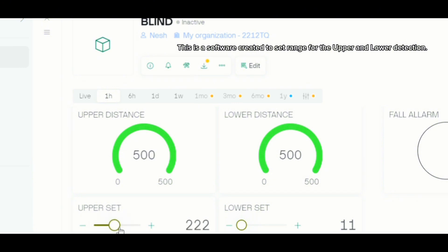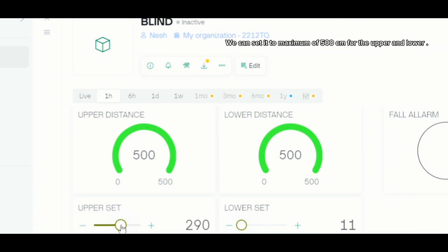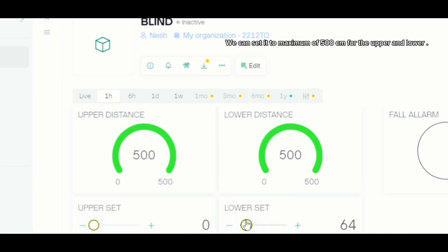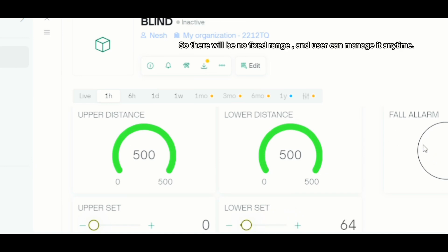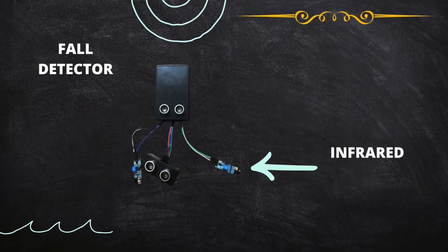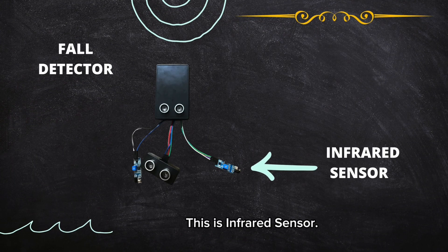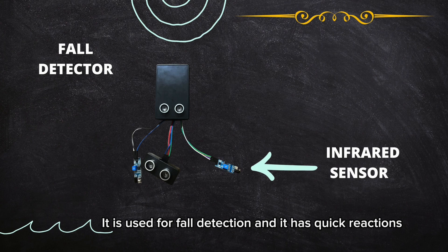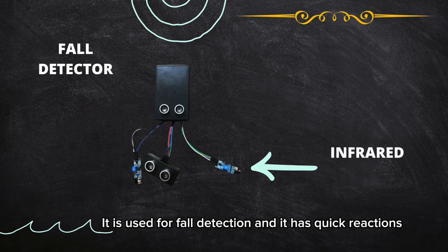This is software created to set the range for the upper and lower detection. We can set it to a maximum of 500 centimeters for both upper and lower, so there will be no fixed range and the user can adjust it anytime.